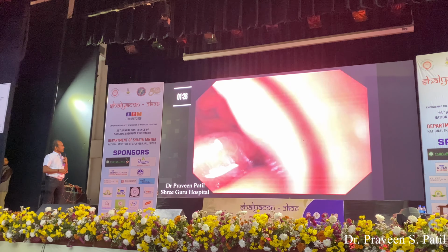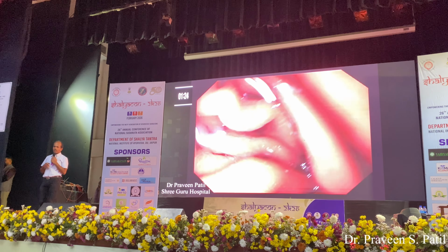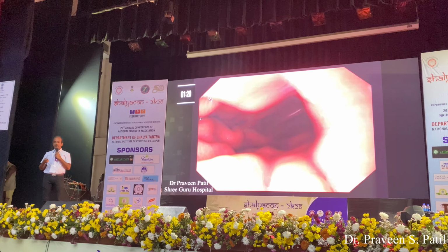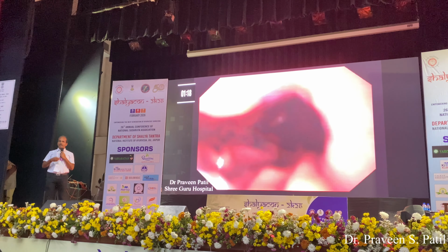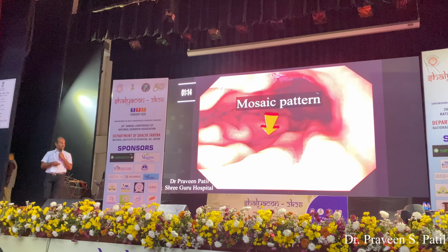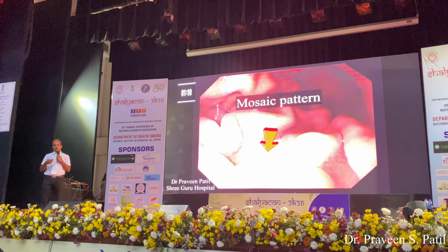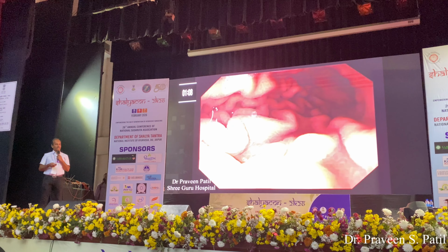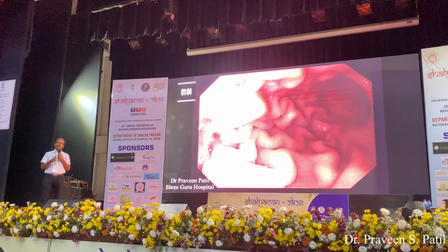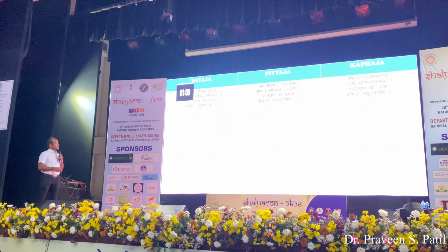Okay. So this is a case, actually this is not an inflammation, this is portal hypertension gastropathy. This is a non-inflammatory condition. Because of the back pressure which develops because of portal vein hypertension, we get a mosaic sign, or the snake skin sign. In this condition the lower esophageal sphincter becomes lax, and that once again causes the GERD symptoms.